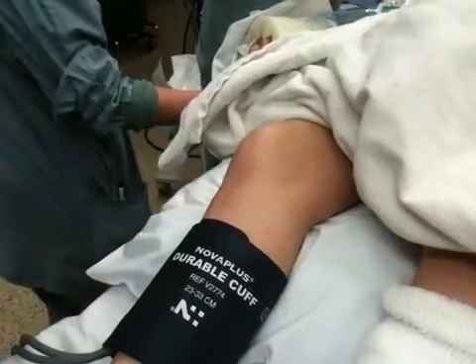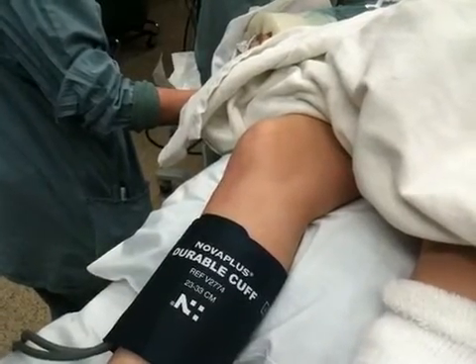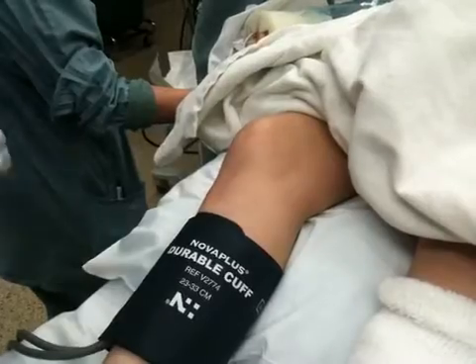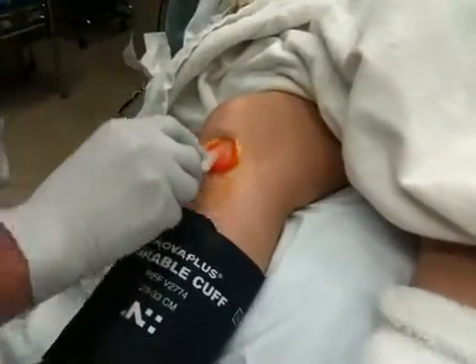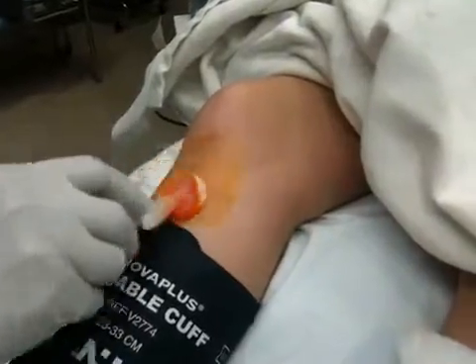So you guys are good with that for now. This will probably be for later. We use a standard chlorhexidine prep like we'd use for any line, any peripheral line.